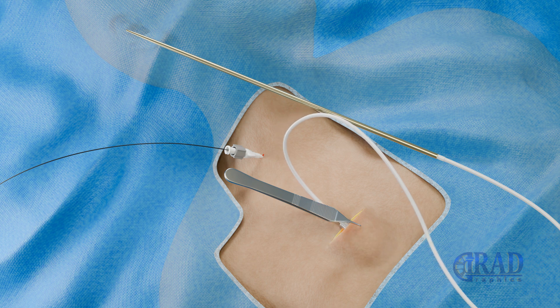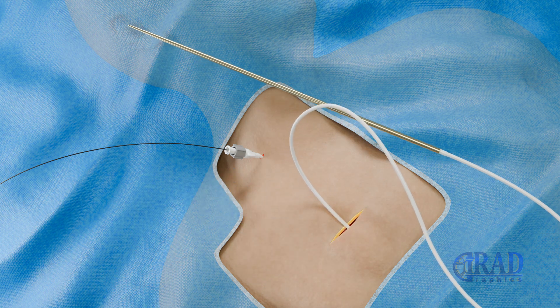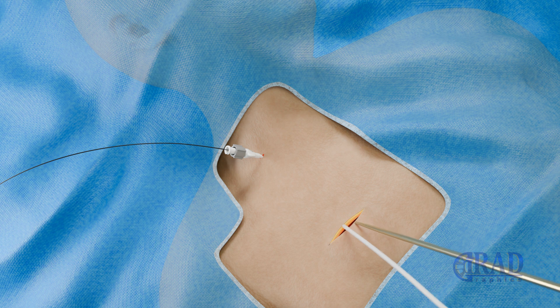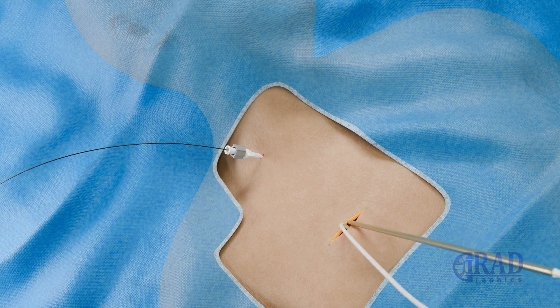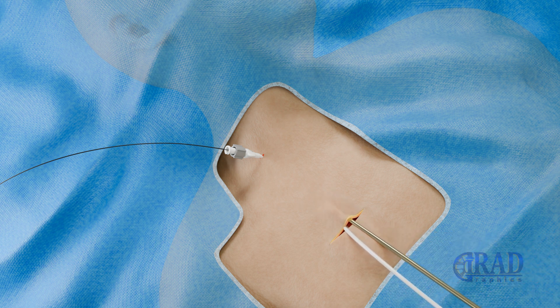Once the port is carefully positioned within the pocket, the catheter is tunneled subcutaneously from the port pocket to the venous access site.